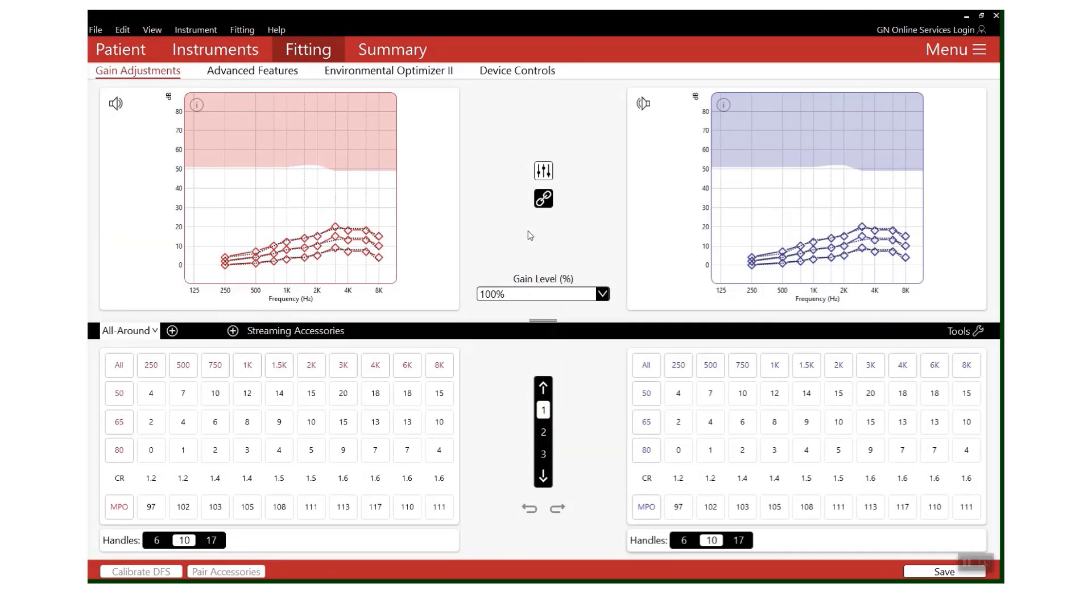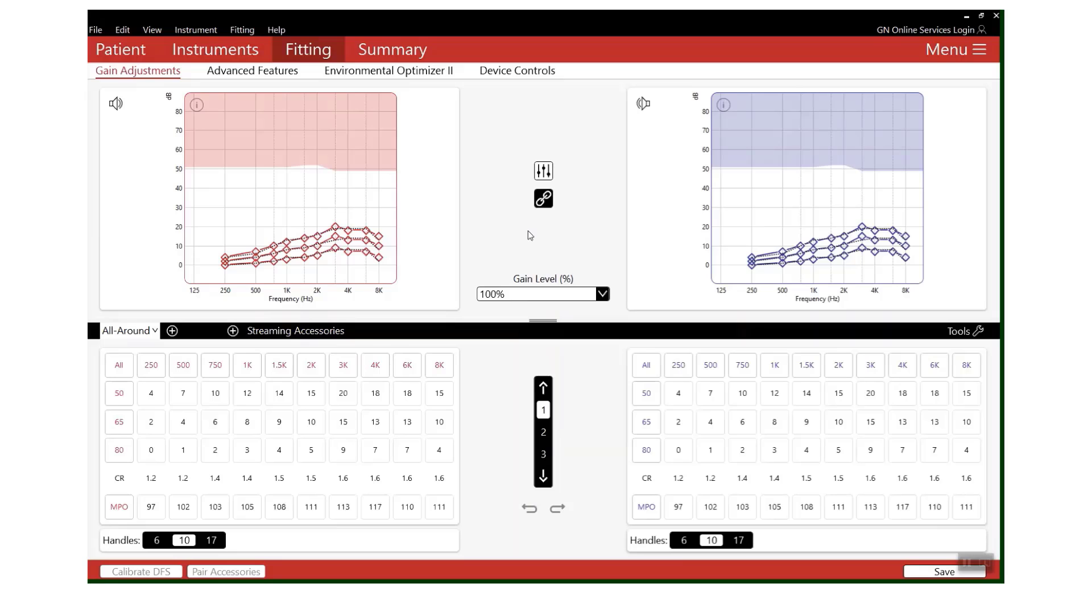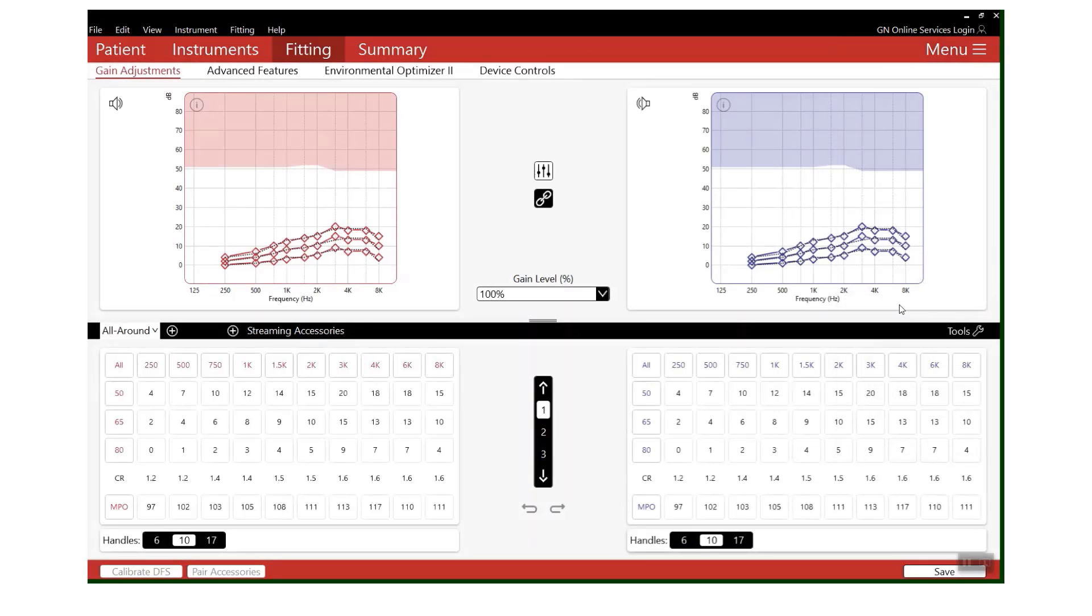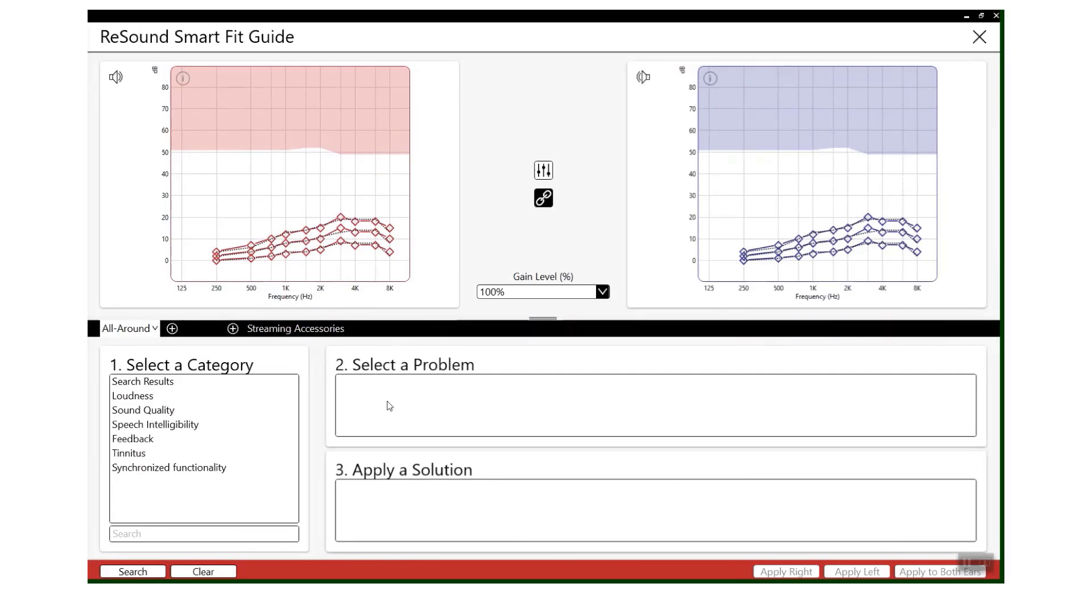Tip number three: the Smart Fit Guide. If you're just beginning to fit GN, or maybe you're just a little bit unsure of what adjustment is going to be best for this particular problem that you've been faced with, do not worry. The Smart Fit Guide will be your perfect little helper. If you go into Menu, come down to ReSound Smart Fit Guide, you will find a catalogue of different issues that you may be faced with and then some solutions that you can try and apply straight from this screen.